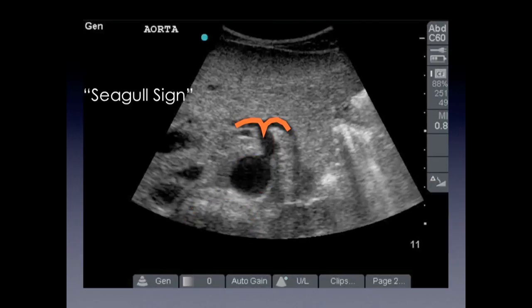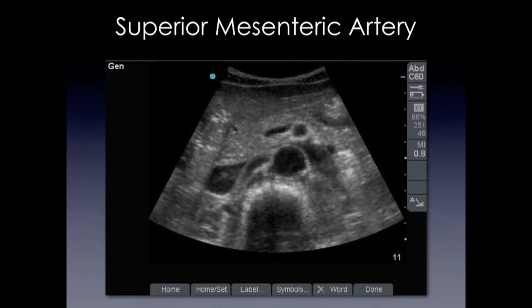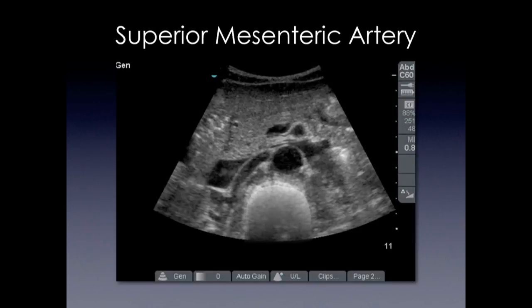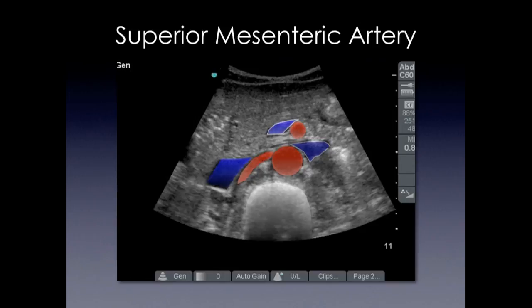We have what's called the seagull sign, where you can see the splenic and common hepatic arteries. As we scroll down the abdomen, you're going to find the superior mesenteric artery. We're looking for our spine again as our landmark, then we find the aorta and the SMA. We can also see the right renal artery, the left renal vein running between the SMA and the aorta, the IVC, and the splenic vein.